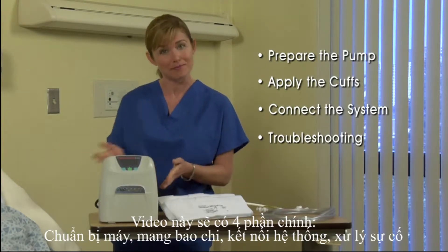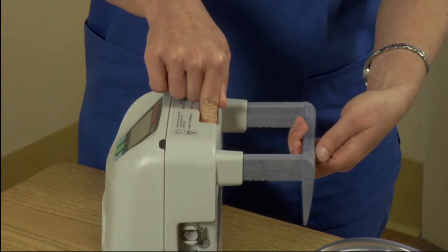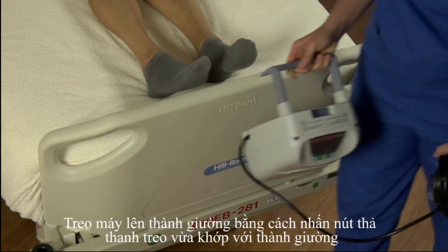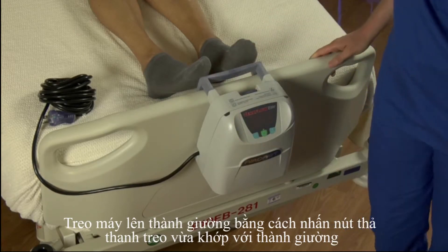Let's begin with the first step: preparing the pump. Press the bed hanger release button here, and gently pull up the telescoping bed hanger to the desired length. Then proceed to hang the pump on the rail or foot of the bed. If needed, you can press the release button and ratchet the hanger back to securely fix the pump on the bed.